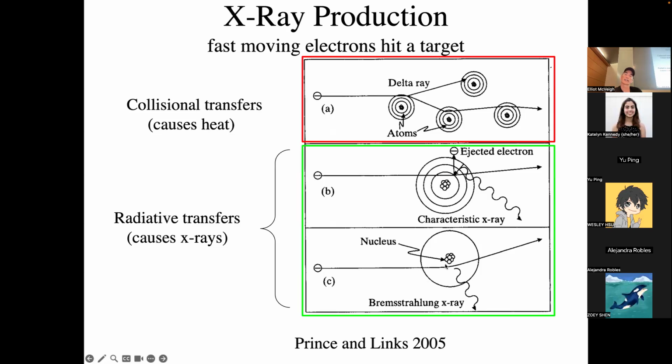And so, if this is a glancing blow, this photon will be of low energy. If it's a direct hit, if the electron goes whoop and gets popped right back, all of the energy goes into the photon and it becomes that high energy photon, that 140 keV photon or whatever. But the vast majority of photons that are created this way are from these glancing blows, because the cross-sectional probability of one of those is so much higher than hitting the nucleus right on. So that's what you get, most of it comes out like this. And you get more and more lower energy photons as time goes on.